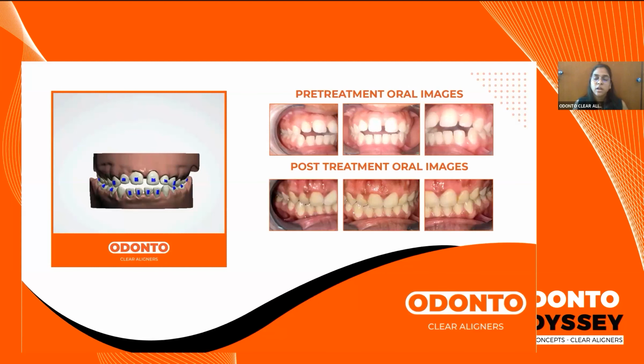And this comes in at around 25 to 30 sets. We can have correction for these malocclusions. In this, we have to first ensure that we are closing all the spaces. And as we close the spaces, it also helps to close the anterior open bite. In this case, we can see that as the teeth have been retracted, we are also closing the bite anteriorly and achieving a good overjet and an overbite.